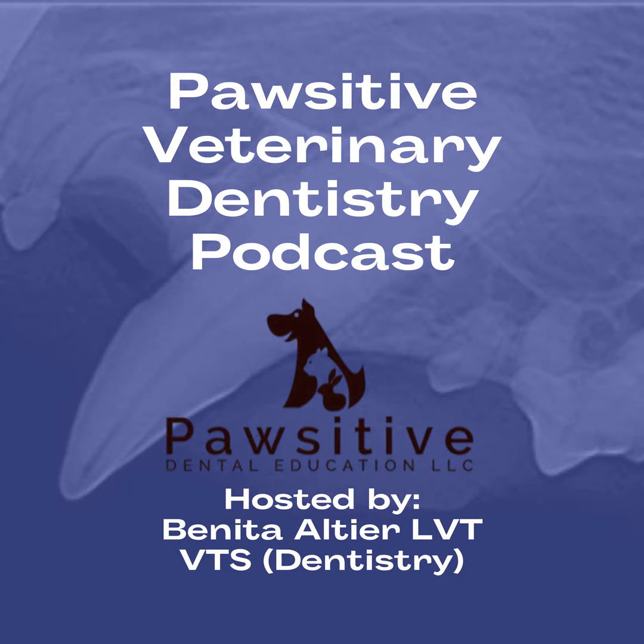14-year-old diabetic train wreck that is not a great anesthetic candidate, I may give the owner a call and say, hey, I'm a little bit concerned with this tooth. I can't necessarily truly tell you whether there's something wrong with it. We can either watch it and have you come back in 6 to 9 months or 9 to 12 months for another radiograph and deal with it at that time. Or if you tell me that you never want to anesthetize this dog or cat ever again, we can be more aggressive and we can extract it, based on my interpretation or my assumption of what I have a concern of is going on.